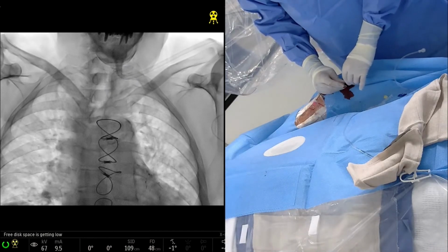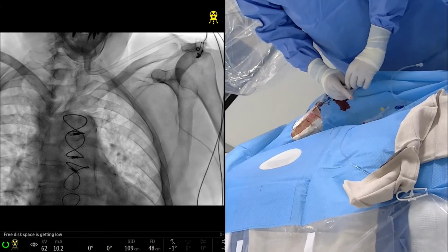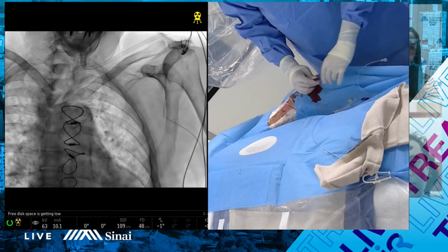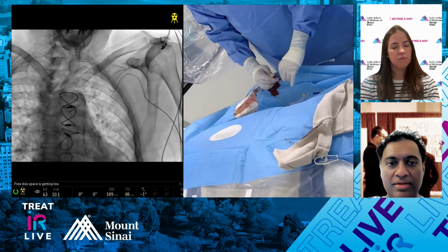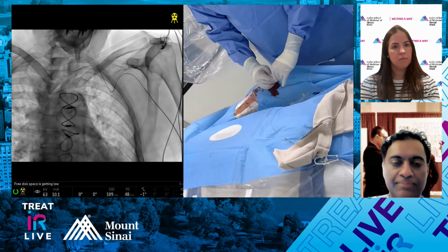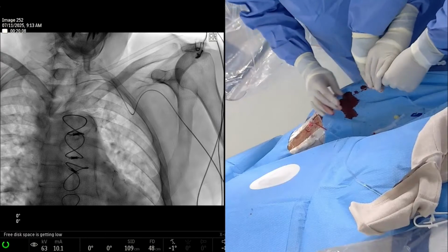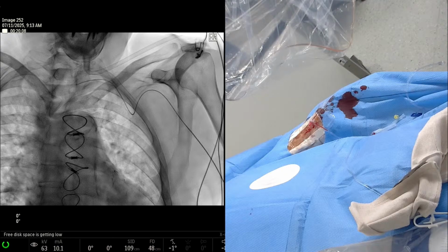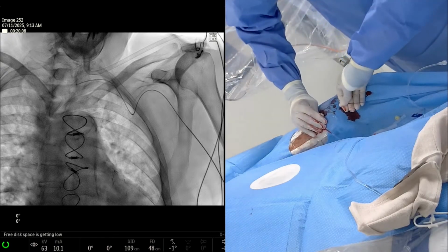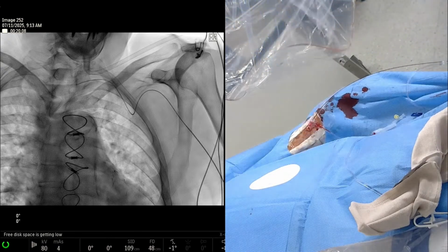And then can you do pre-op cross-sectional imaging of the arch and subclavian, or is there a guide? We looked at it. Okay. Yeah, we looked. We're going to switch this out. I'm going to just take the Simmons. We look at the arch just to make sure there's no disease, especially if we have imaging. We're not getting pre-op imaging on these patients typically of the chest. We haven't really run into issues.